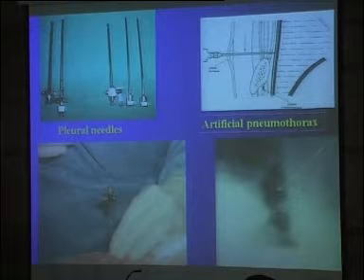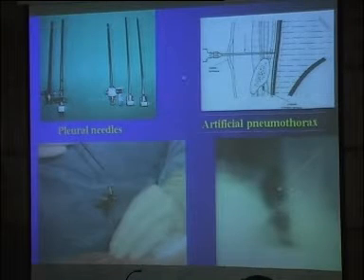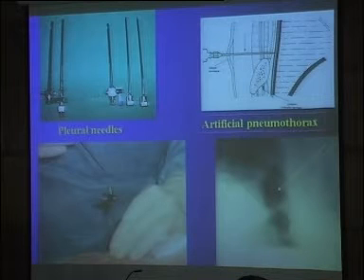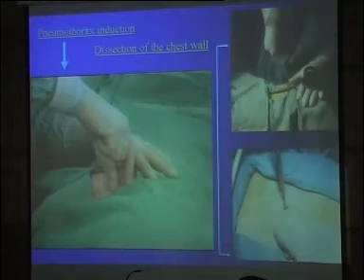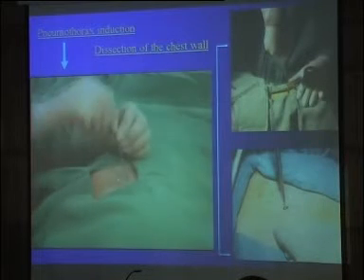can perform artificial pneumothorax in dogs with healthy pleura, for sure. In patients with 2 liters of fluid or 1 liter of fluid in the pleural cavity, it's easier to replace the fluid with air. It's not a big deal. The first step is to create the artificial pneumothorax.